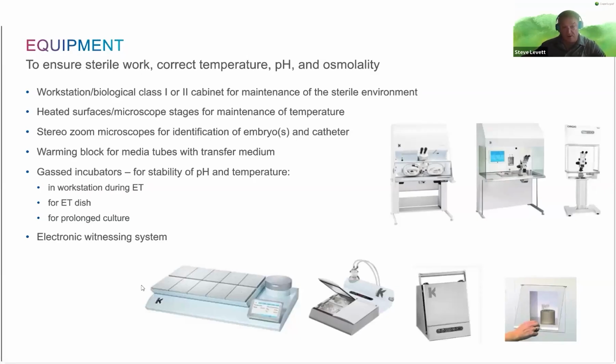We will talk in a little while about which embryo transfer medium to use and how we set things up, but needless to say, if we don't have good equipment working around the embryo transfer process, we're not going to get the best results. So be it the workstation, the incubator, the plasticware that we use, all of those things play a part in achieving an optimal outcome.